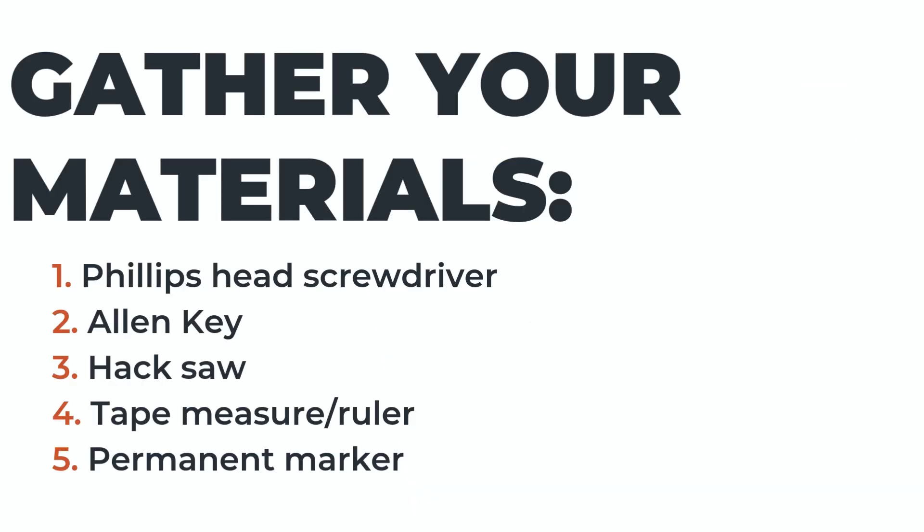First, make sure to gather all of the materials that you need. In addition to the elbow joint and your pet's prosthesis, you will need a Phillips head screwdriver, your allen key that was provided with your prosthesis, a hacksaw, a tape measure or ruler, and a permanent marker.